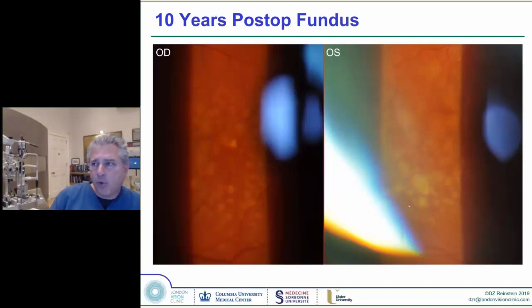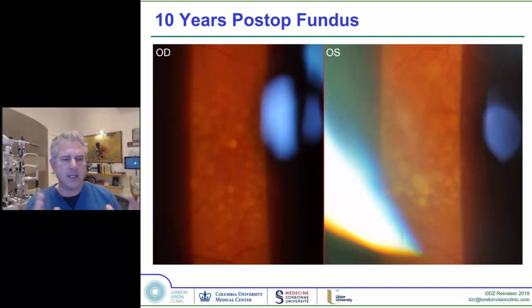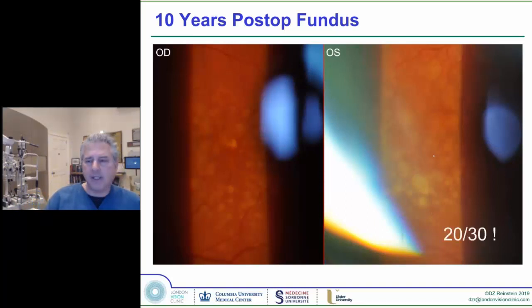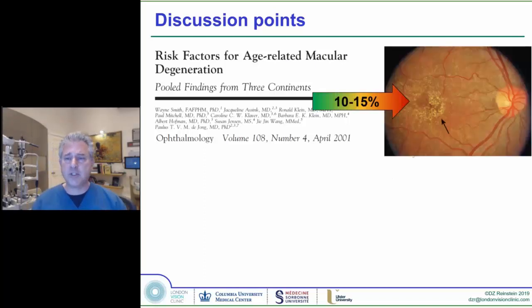And this is a prime example of where you can have a clear OCT at the age of 55 or 60, and 10 years later, you've developed macular changes, and now you have a diffractive, light-cutting, contrast-compromising IOL in the visual pathway. So her maculae were 20/30, and so therefore it is a good thing that we didn't do cataract surgery, which might have accelerated her dry macular degeneration into wet.